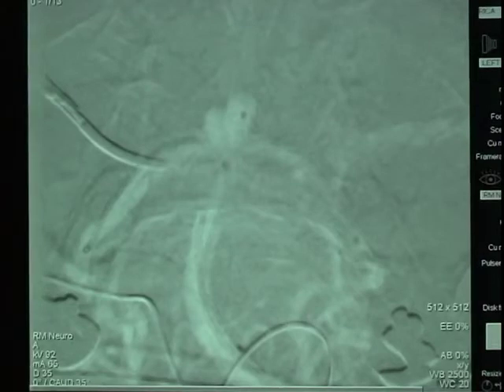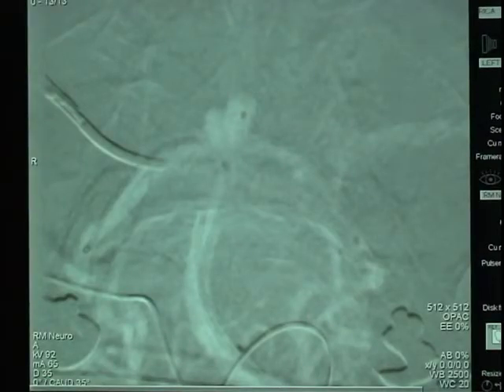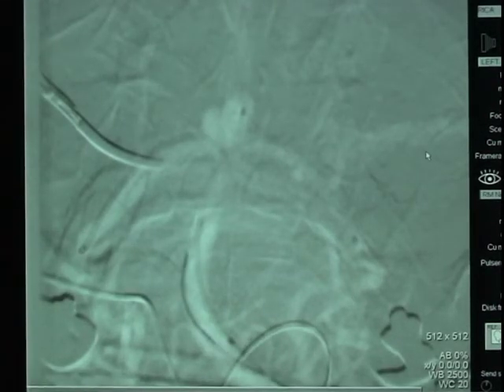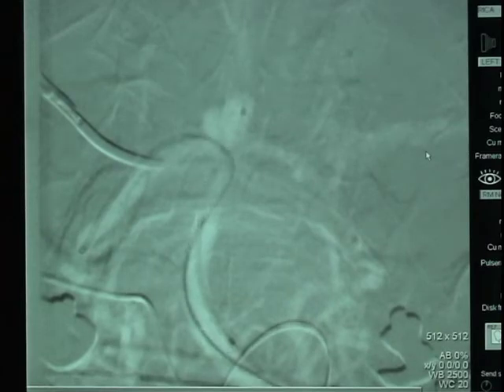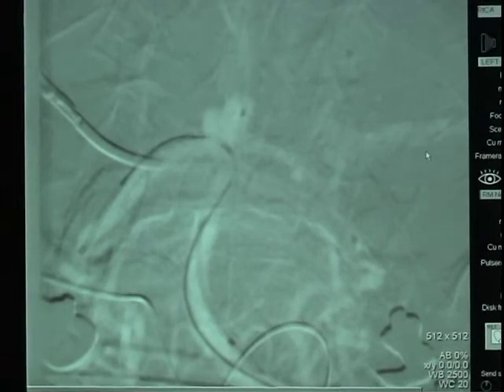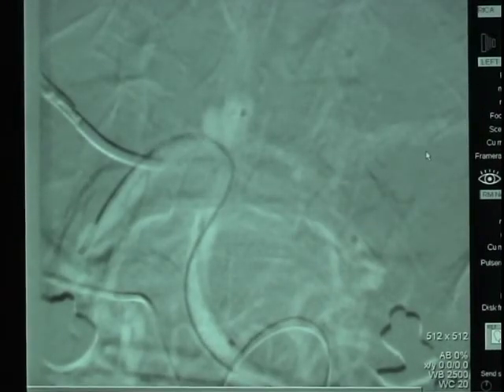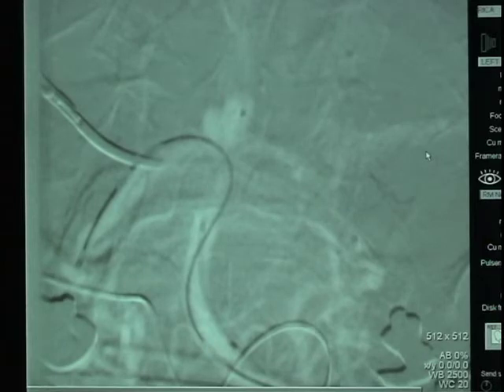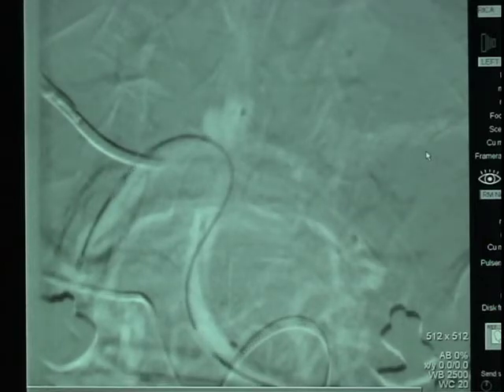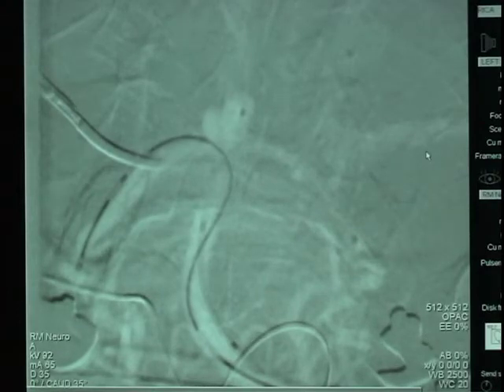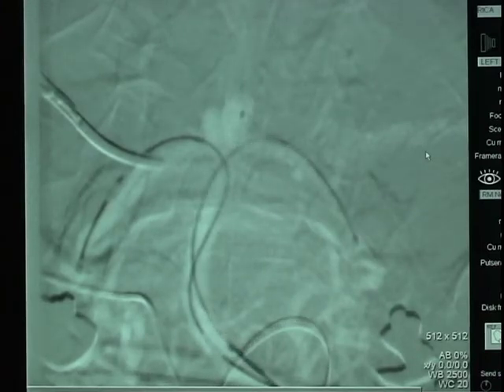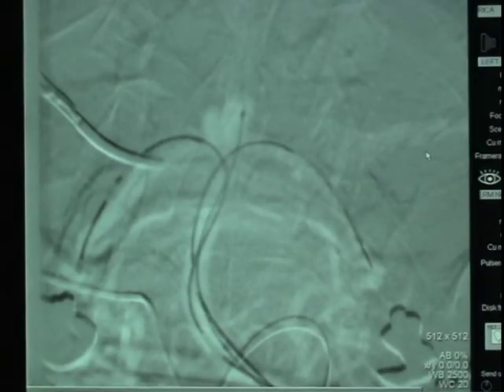Here a run shows all catheters in position. The first enterprise neck remodeling device, or stent, is being advanced into the right posterior cerebral artery through the catheter, so that part of the stent lies within the posterior cerebral artery on the right side and part of it lies within the basilar artery. A second neck remodeling device is advanced into the catheter that sits in the left posterior cerebral artery. We now have our two stents in position.